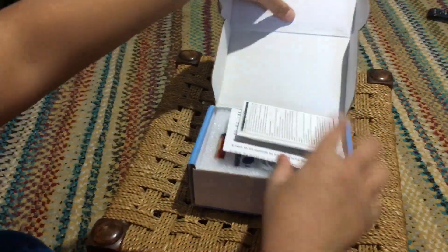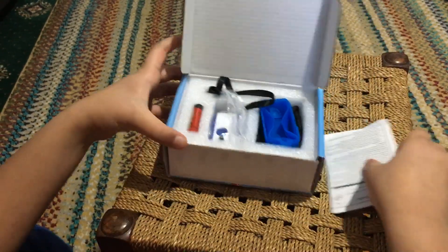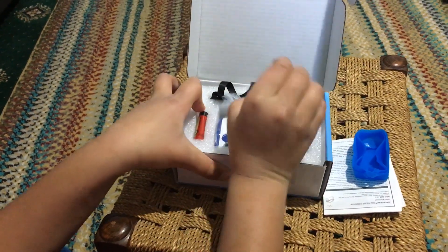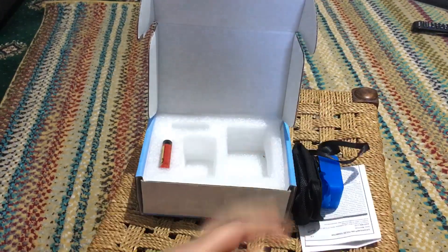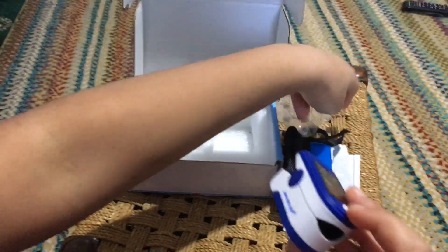There is a quick guide with more detail information. This is the cover for the oximeter, this is the bag for the oximeter, and this is like a lanyard for doctors if you want to put it around your neck. And this is the oximeter, guys.